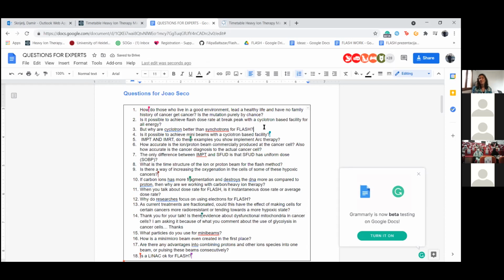And the reason is the target. That target is not prepared for flash. It would literally melt with the amount of intensity.